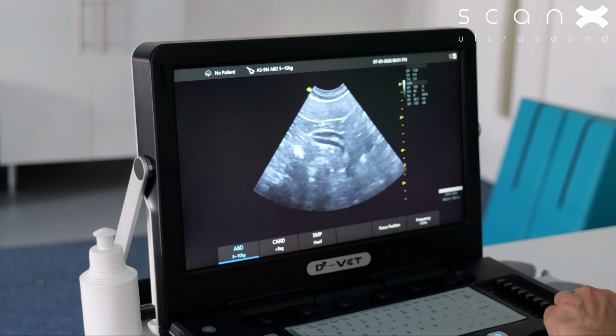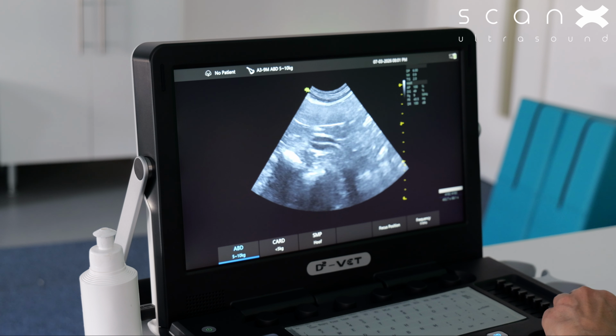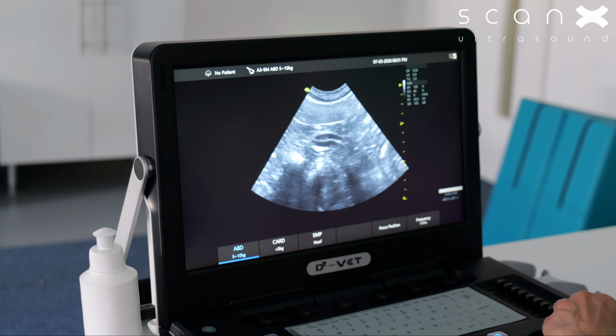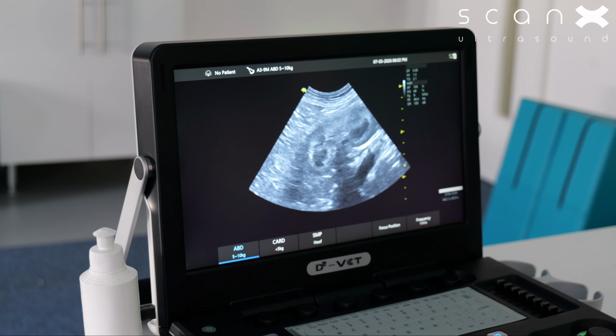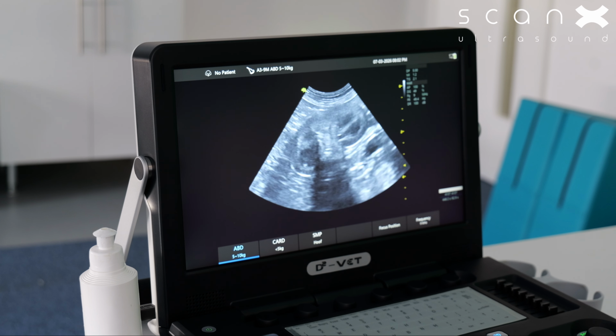There's a small intestinal loop. There you can see better. It's good enough to see the layering of the small intestine quite well. You can see them nicely. That's a nicer picture. That's enough for the kidney. Can you see? Yeah, beautiful.